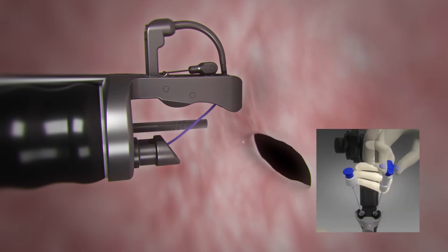Advance the tissue helix through the 2.8 millimeter scope channel. Push down on the blue knob to expose the helix. Advance the helix to target the appropriate tissue.